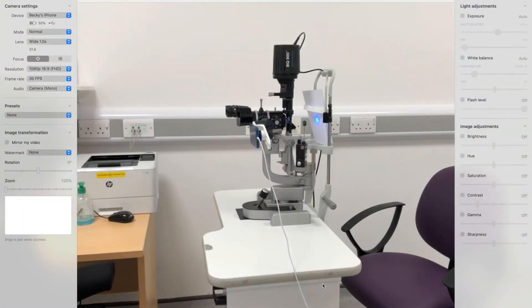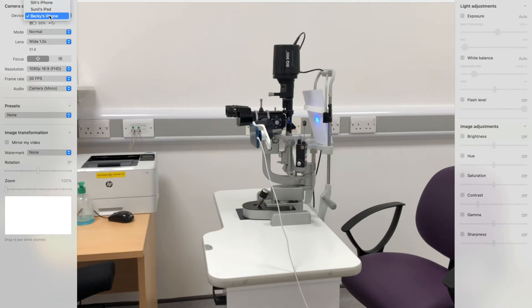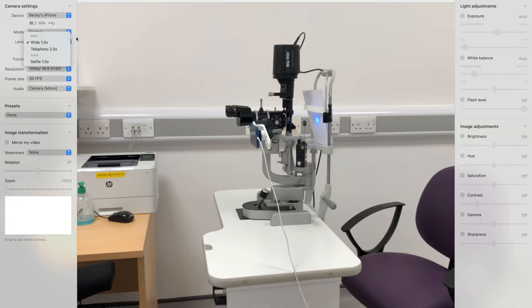We're now going to show you how we used the app Camo to run our virtual slit lamp grand round. It's a really useful app which allows you to have multiple video input sources and change between these on the fly whilst you're broadcasting. Here we're selecting different input devices. You can see the image right now demonstrates the slit lamp in the room, but we have the option to change between different types of lenses, using the zoom lens, the wide field lens, the resolution, the frame rate, and even the audio.